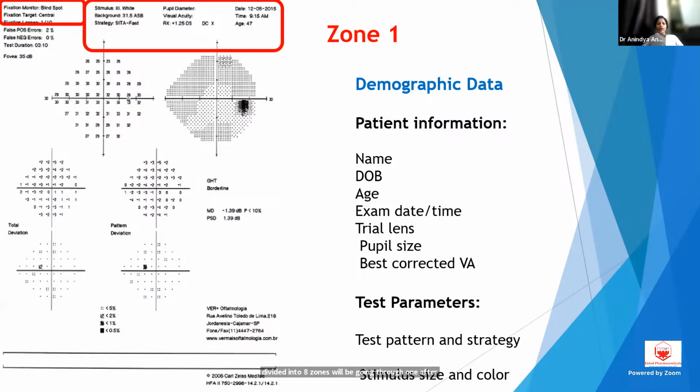That's the demographic data or the test, and also the test parameters. In the demographic data, you have to match that yes, you are doing the correct patient, correct age. Suppose your age introduction is wrong. In that case, because in visual field everything is correlated as per the age, the outcome will be faulty.